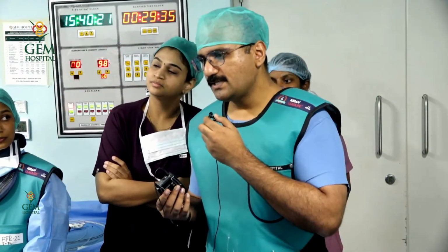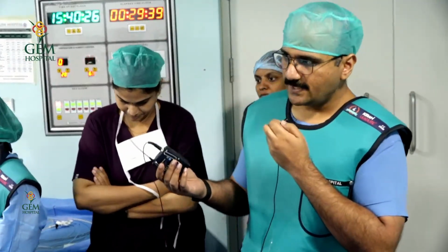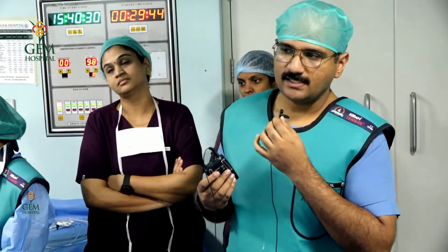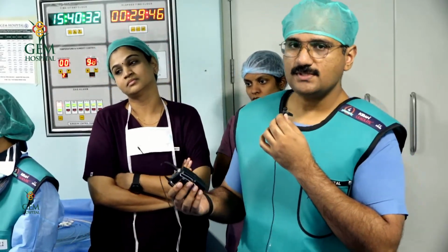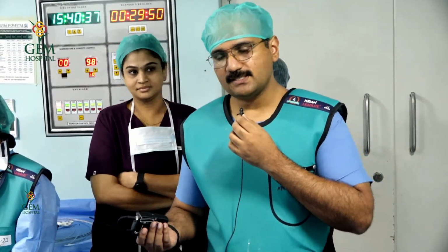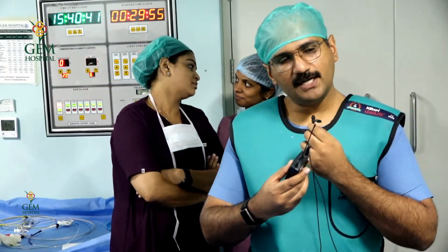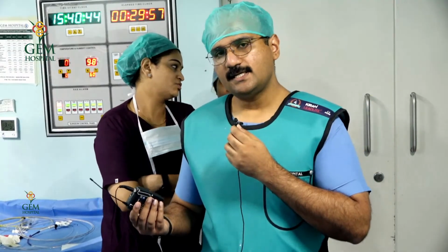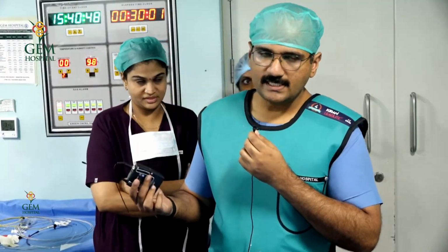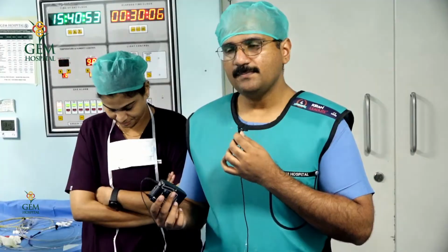For post-op follow-up of this patient, since we had an inadvertent single PD cannulation despite a pre-cut sphincterotomy, we'll be watchful of post-ERCP pancreatitis. But we have taken care of that right in the beginning by giving rectal diclofenac or indomethacin. In this case, we have given a Zonac suppository of 100 mg and adequate fluids. The creatinine status was monitored before, so every parameter has been taken care of, and it was a single guide wire entry, so the risk of post-ERCP pancreatitis is minimal.